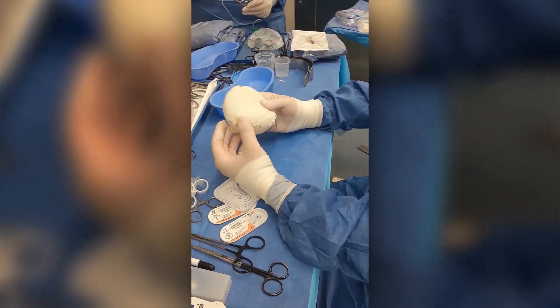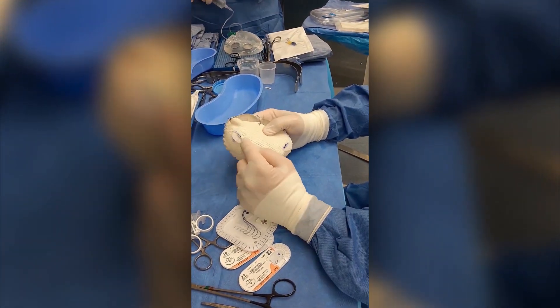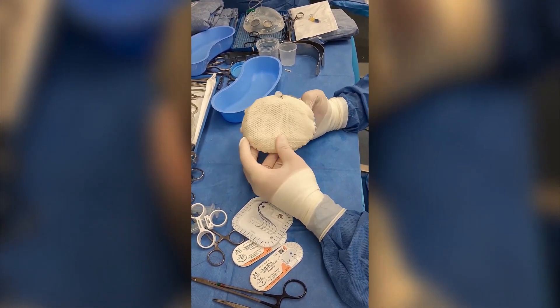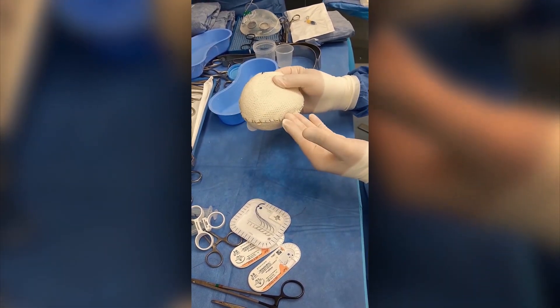Here's the final product. I've made the slit here and here, I've brought these tabs out, and I've sewn them in place. The back is partially covered while the anterior part of the device is totally covered, and you can see the seam isn't on the bottom — it's actually a little bit up higher.